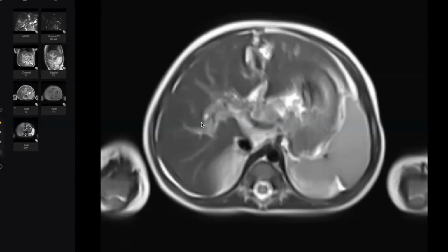One piece of advice from my exam: they presented us with a very tricky case in long reporting. It was a neonate, and they gave us a HIDA scan and a confusing ultrasound, with many signs favoring biliary atresia and many signs against it. It was the most difficult and also the easiest case. You will not face a HIDA scan in FRCR without biliary atresia. So I reported the case as biliary atresia.